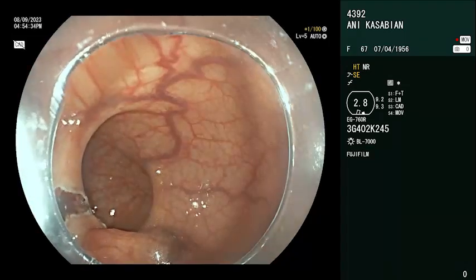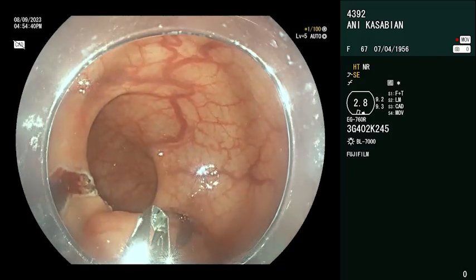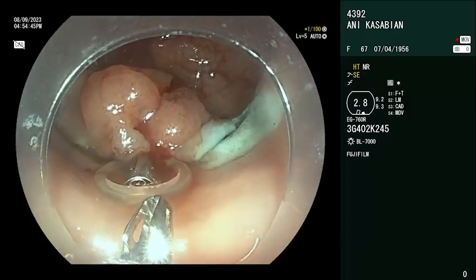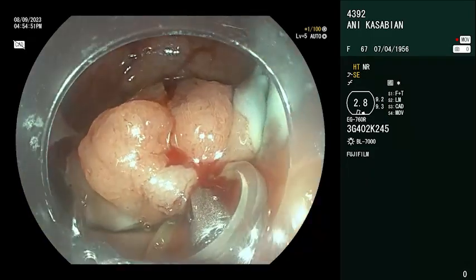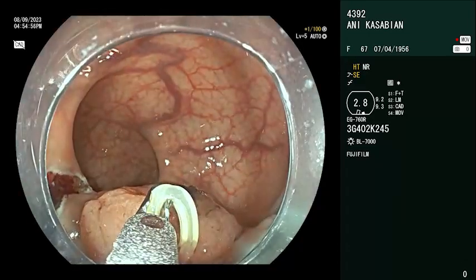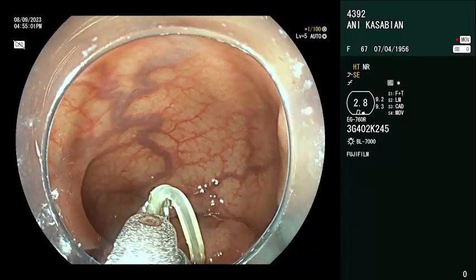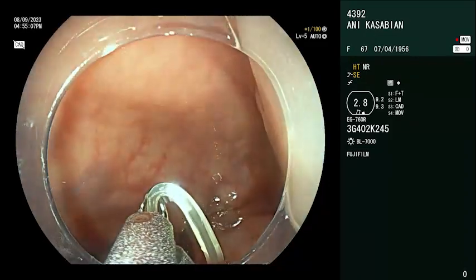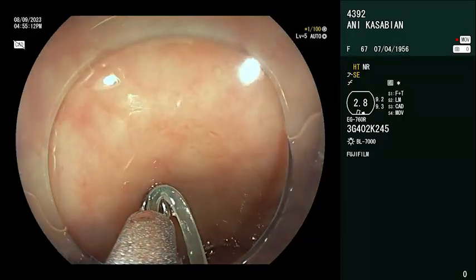It's quite bleeding, and there is this fibrotic part in the anal site, which is quite difficult to make for the dissection. Open, please. Okay. Close. Okay. Now I will just make a target, exsufflate, not pushing too much to have no injury in the lesion. Exsufflate, exsufflate. And I think that here it could be nice.